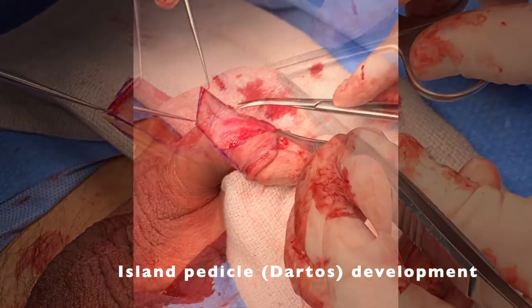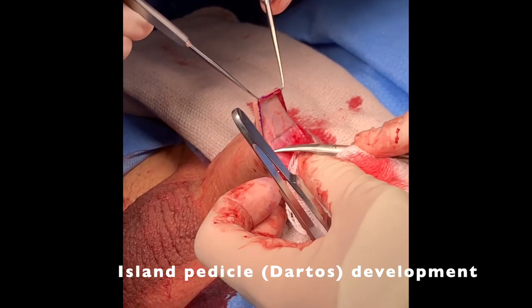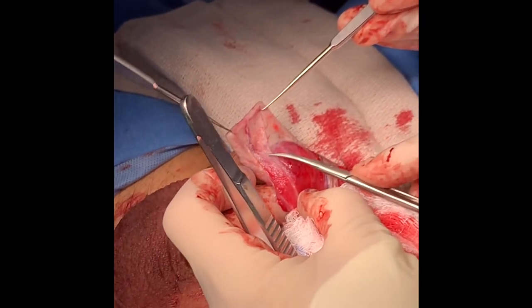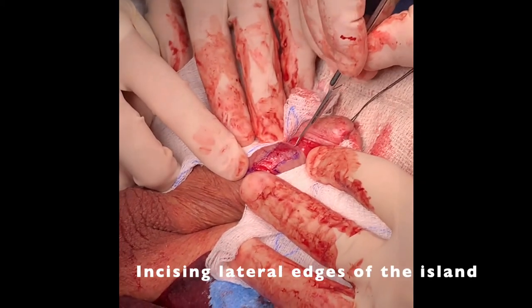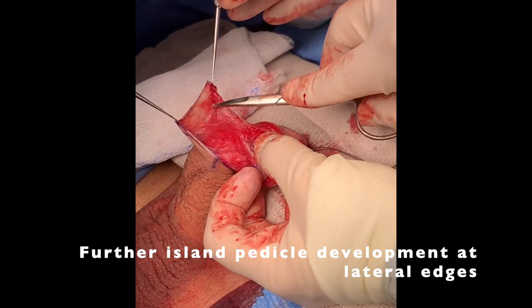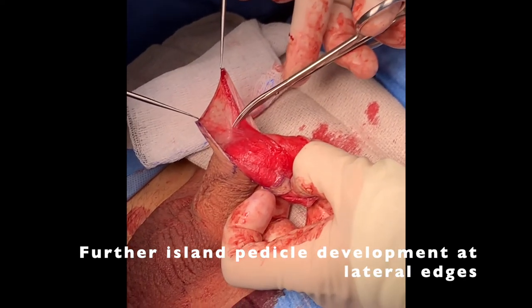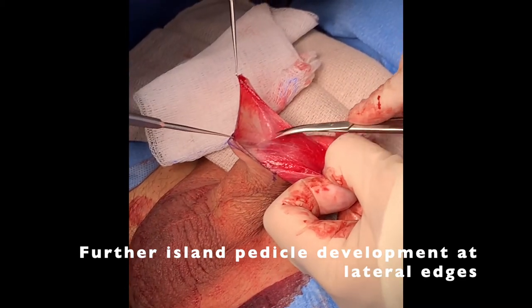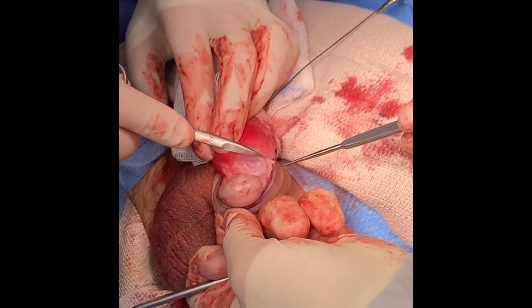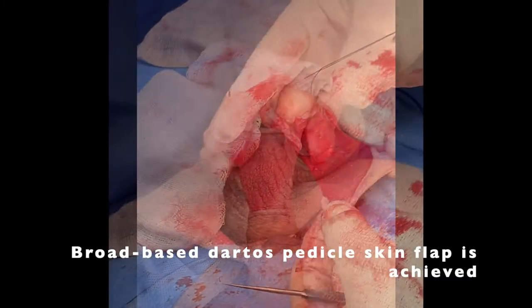Care is taken to avoid injuring subcuticular penile skin vessels. The sides of the flap were incised, and first the right and then the left side was liberated from the underlying Dartos. To promote careful tissue handling and preserve tissue integrity, single skin hooks were used for exposure rather than forceps. The final pedicle was noted to be broad and well vascularized.